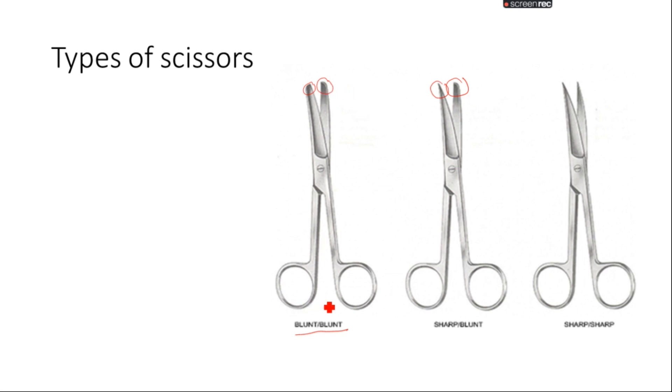Here there is no point, so blunt and blunt. Sharp and blunt. And in the sharp and sharp, the two sides of the points have edges, are pointed, they are having a point, so they are known as sharp and sharp scissors.